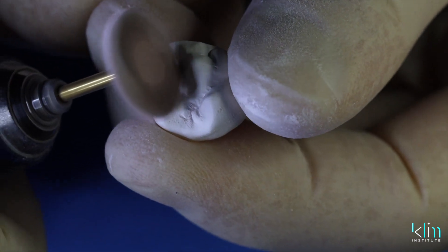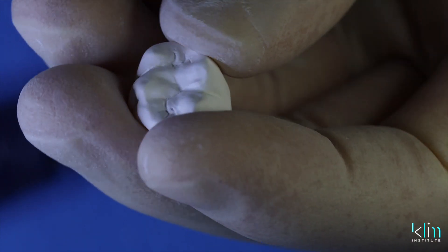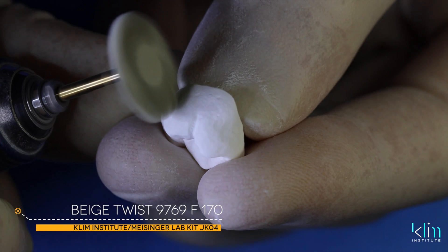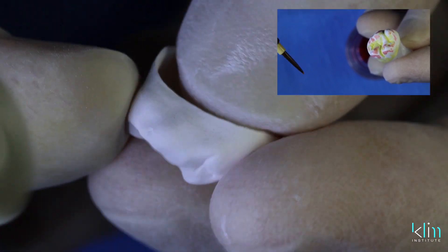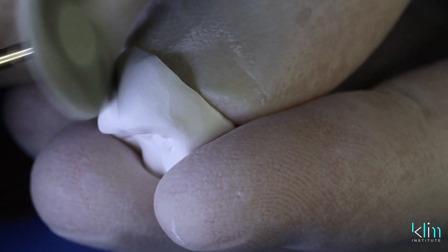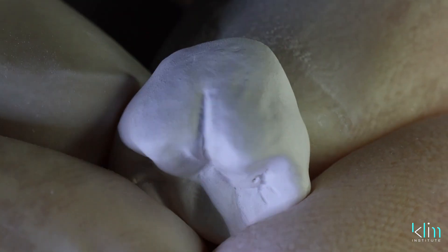The final pre-sintering luster polish happens with the beige twist. I use this if I'm not going to infiltrate — if you infiltrate, this may marbleize and create a really smooth zirconia surface where your infiltration will not infuse. When I'm not infiltrating, this really creates a beautiful luster when it comes out of the sintering furnace. As before, polish away from the margins with soft action. You can polish a bit on the proximal contact — this won't necessarily open it up — and there's that beautiful labial texturing.